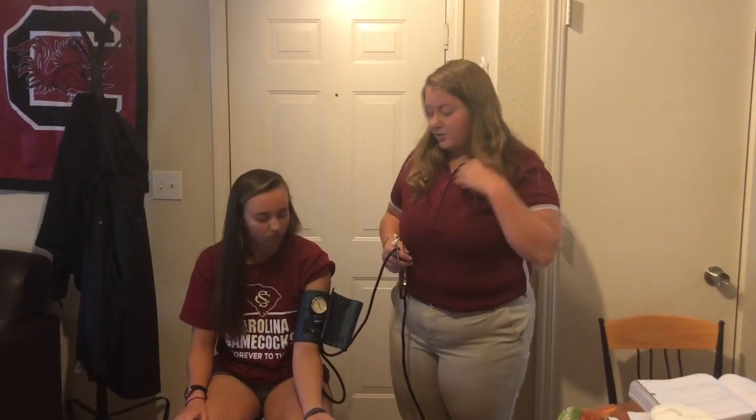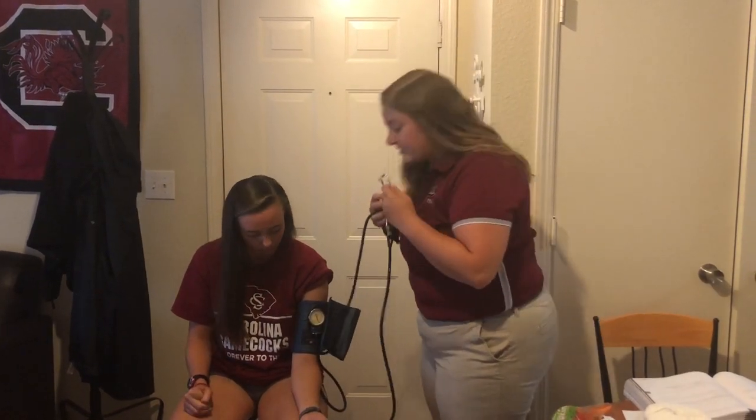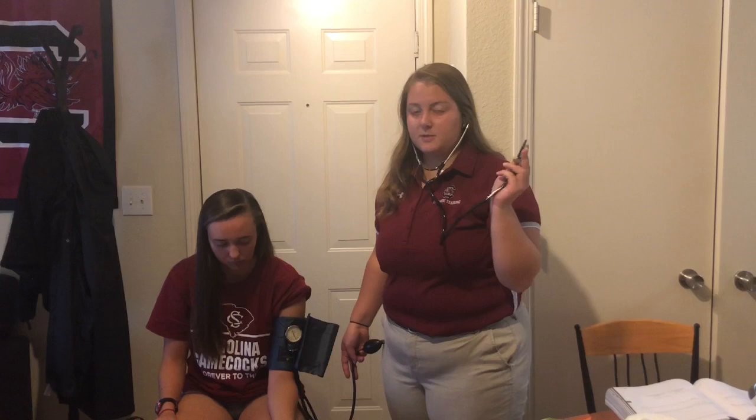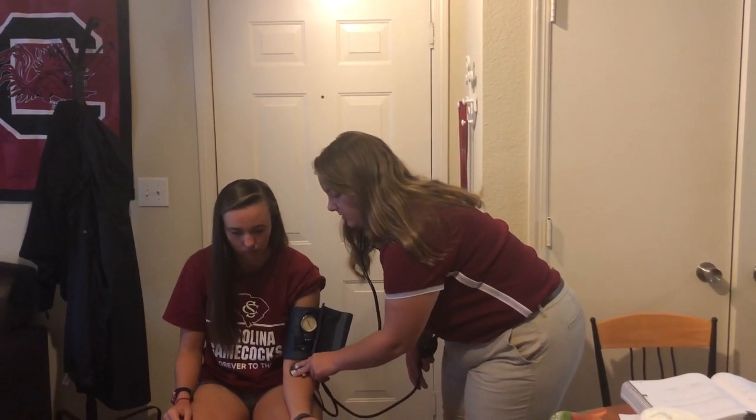Next, I'm going to instruct the patient to relax their arm. While they relax, I'm going to put on my stethoscope. Ensure that your fingers are on the side of the stethoscope and you're not using your thumb, so you can't hear your own pulse. Place it directly over the cubital fossa.